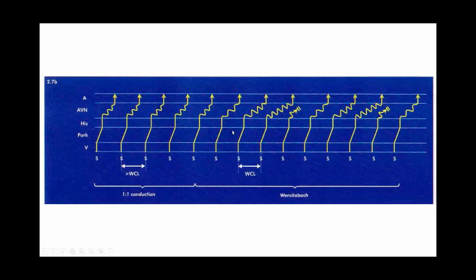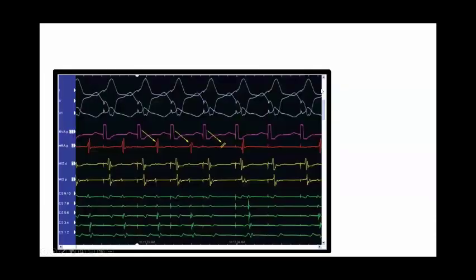Here, this is the straight pacing, and now it takes more time when the rate is increasing, until I reach the refractory period of the AV node and the impulse is not conducted. This is an example. We call this Wenckebach cycle length.